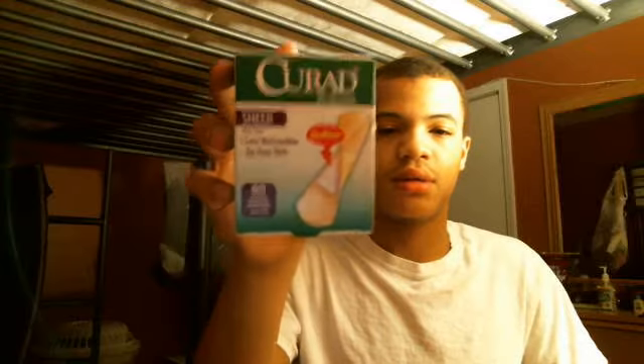These are band-aids that you just put on your skin when you have a scratch or something. Just put this on your skin and it'll help heal. So if you have scratches on your body, go out there and put these on and they'll help heal your body.